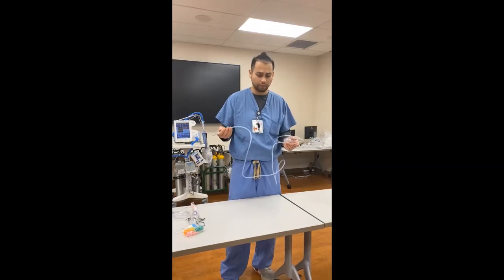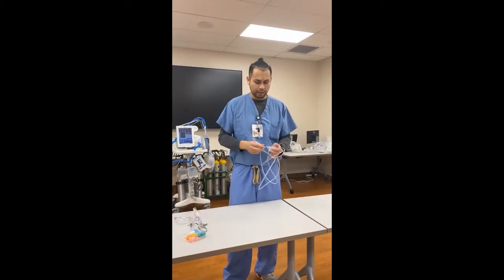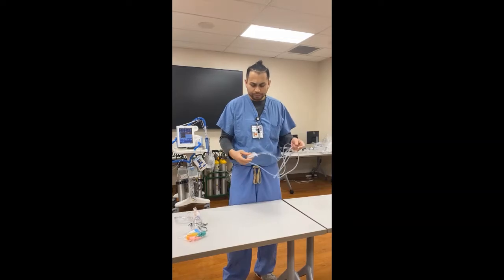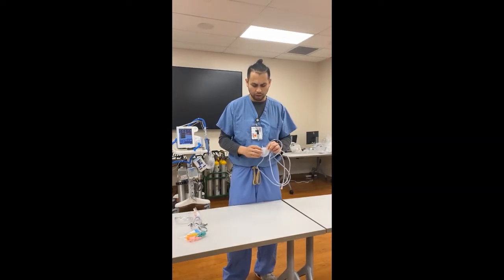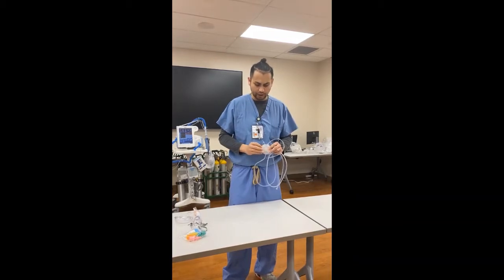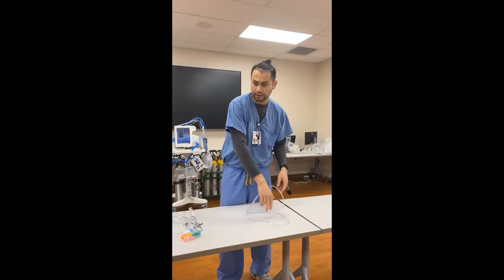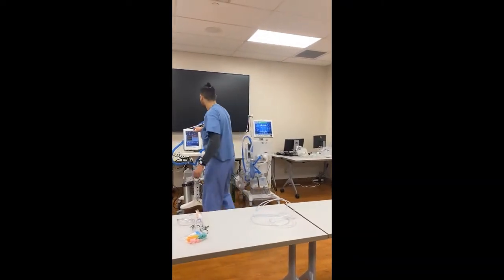So if a patient is desatting, say they're at 88% on 8 liters per minute, you can increase that to anywhere from 10 to 12, or even max them out at 15 liters to help with their oxygen needs. This device has a reservoir holder in here, and anytime they breathe in, they're able to get a good dose of oxygen from here. And again, that liter flow is from 8 to 15 liters per minute.